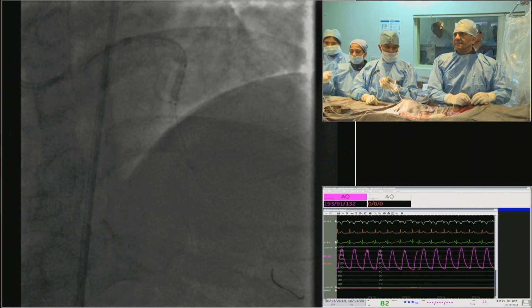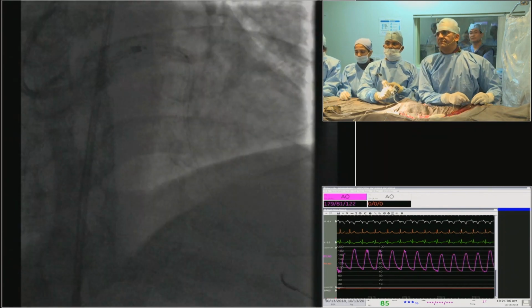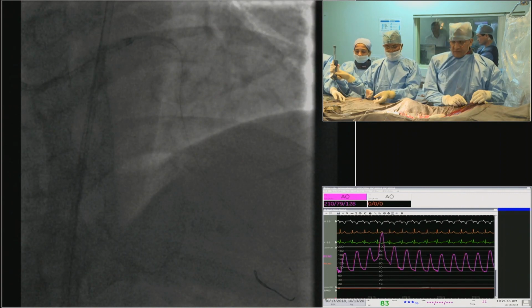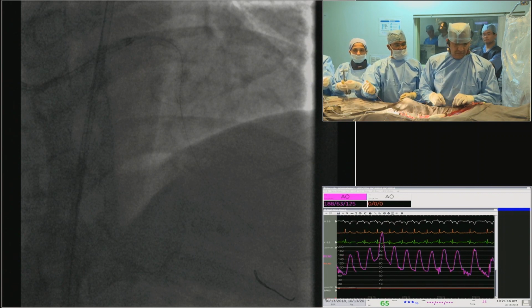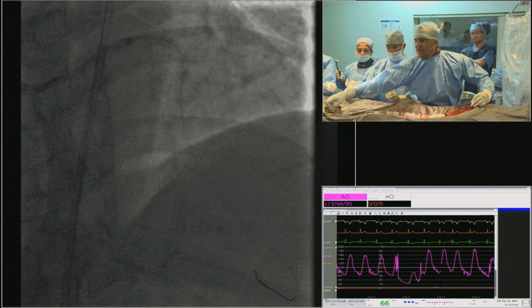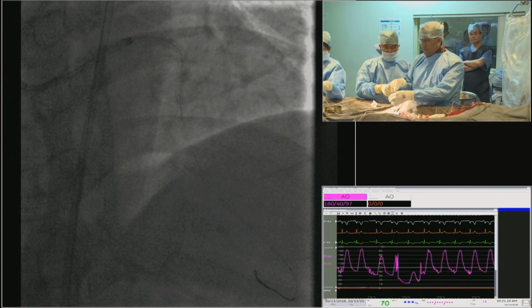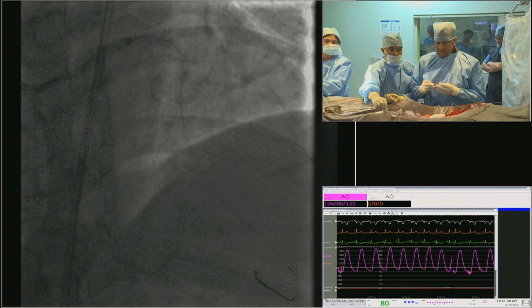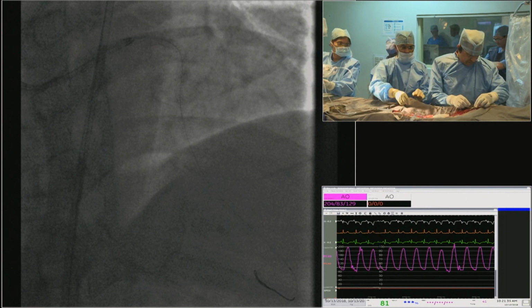This is a 3 NC? Yeah, 3M. Not NC. He's taken a semi-compliant. Somehow I don't use NC balloons anymore. So this is another issue: how many people are still using a lot of non-compliant balloons? Well, a large majority. Even for a POT or a re-POT, are you still using a non-compliant balloon, or do you believe in using a semi-compliant balloon? There is a small minority which believes in using a semi-compliant balloon, but everybody here still believes in using a non-compliant balloon.